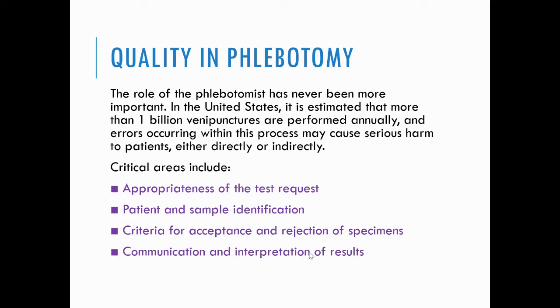So again, the critical area to remember when doing phlebotomy is the appropriateness of the test request. Whatever test request is needed, we need to be careful about the tubes and the materials that we'll be using, the type of tubes that we'll be using.